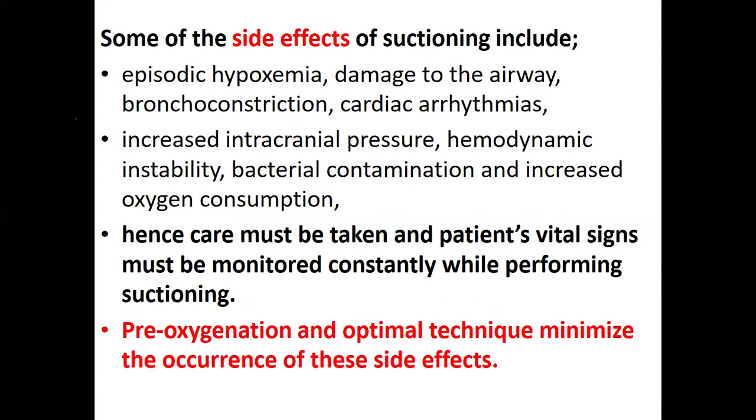Some of the side effects of suctioning include episodic hypoxemia, which we've already talked about, increased intracranial pressure, bacterial contamination, and increased oxygen consumption. Hence, care must be taken and patients' vital signs must be monitored constantly while performing suctioning.